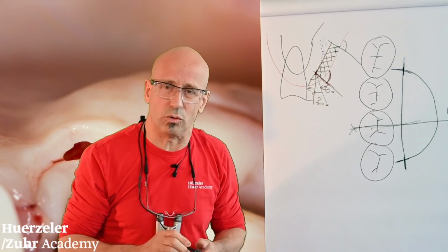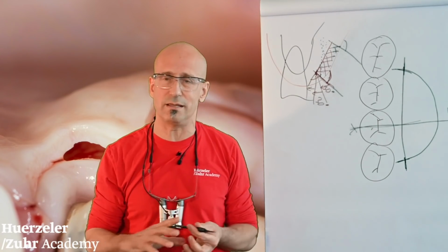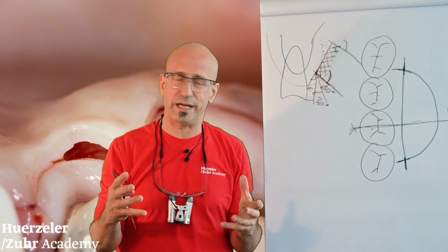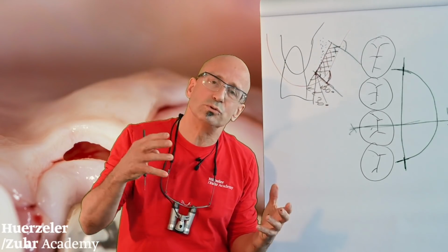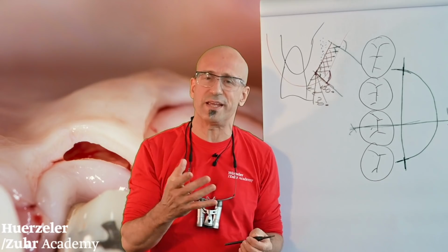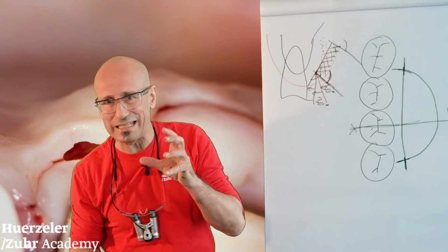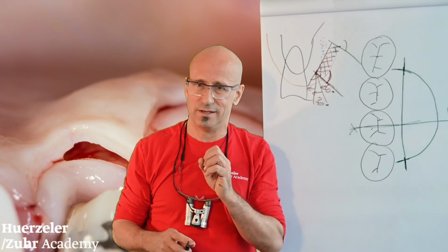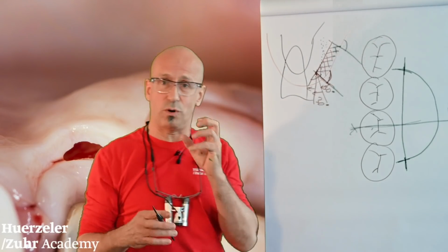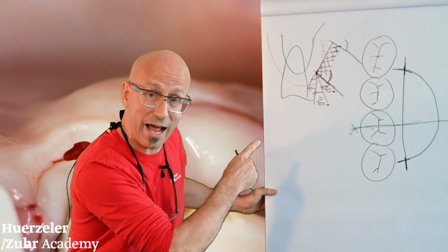As a major goal, when it comes to flap design around teeth, you have to create a flap thickness of 1 to 2 millimeters. So a flap thickness of 1.4, 1.5 millimeter is the ideal thickness of a flap around the tooth. So that's what we have to achieve. So our first incision, and that's what we want to do now also for the graft.